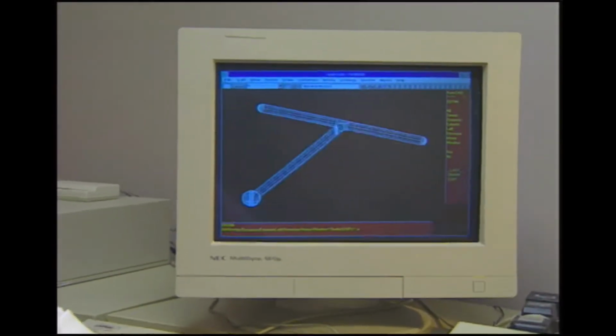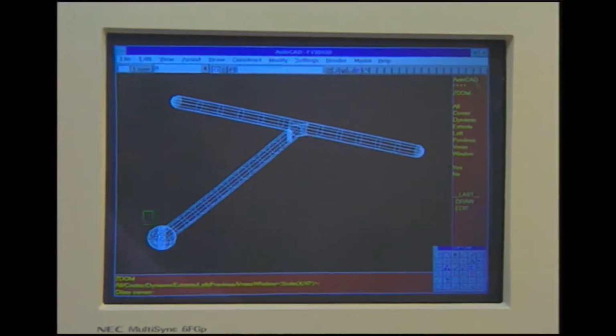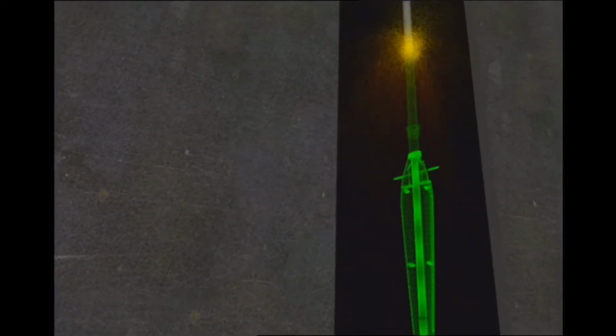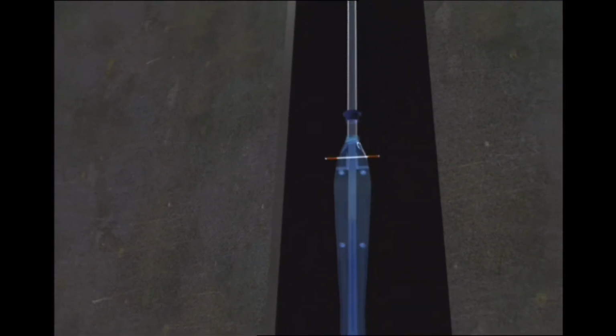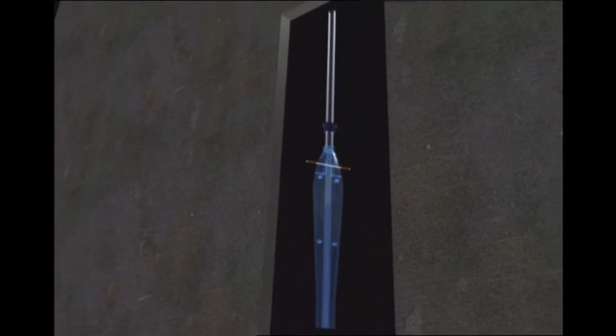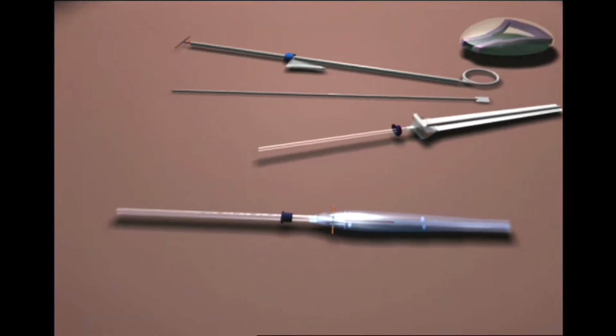Advanced computer-aided design techniques were used to model and construct stereolithographic representations that could be used to make one-of-a-kind models for marketing evaluation. Different designs were field-tested by physicians in order to optimize the final design. Finite element analysis was used to adjust the design in order to minimize stresses on the T during the loading process.